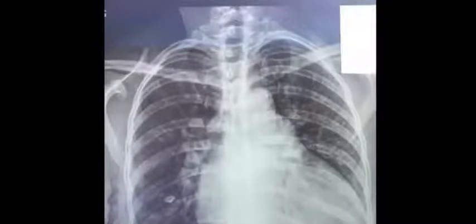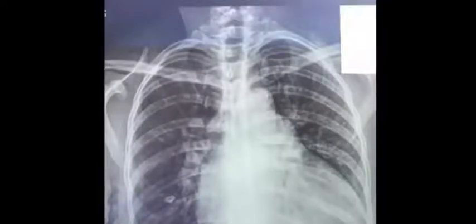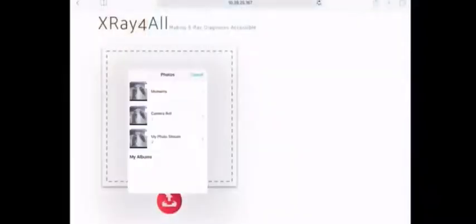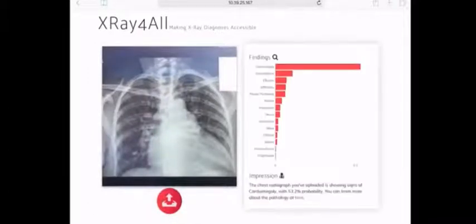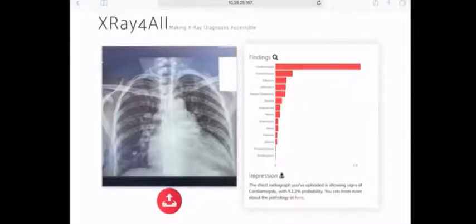First things first — if we look at the x-ray and ask a radiologist to make a diagnosis, they would say there's an enlarged heart here. It's a case of cardiomegaly. So we're going to see if our algorithm could come to the same conclusion. I click upload and use the picture we took. Now it's running through the algorithm, and on the right we can see it's come out with all these pathologies. On top is cardiomegaly — the enlarged heart. The algorithm got it right.